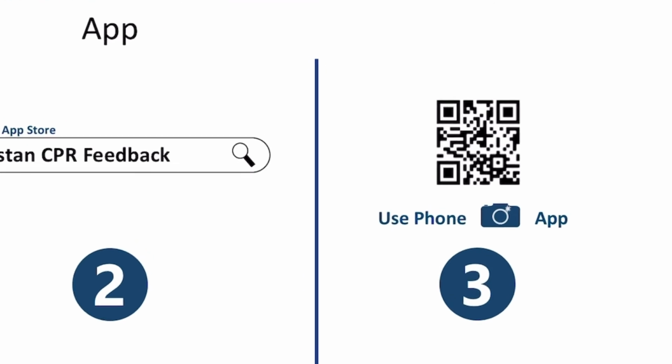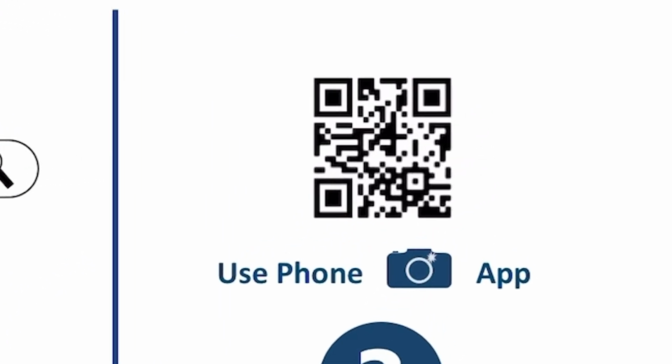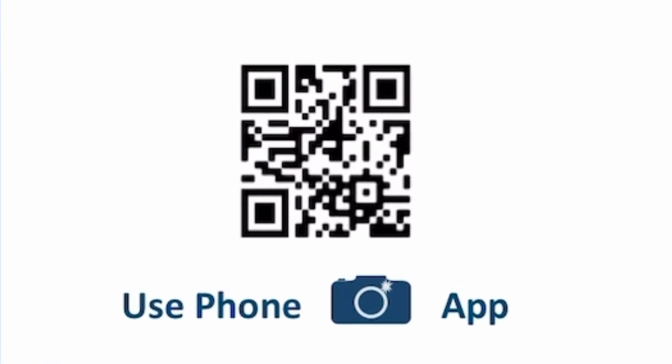The PRESTAN CPR feedback app allows instructors to provide comprehensive CPR training while monitoring CPR performance for up to 6 students at a time. This app is also equipped with a reporting feature that allows for CPR training results to be downloaded or printed directly from the app.